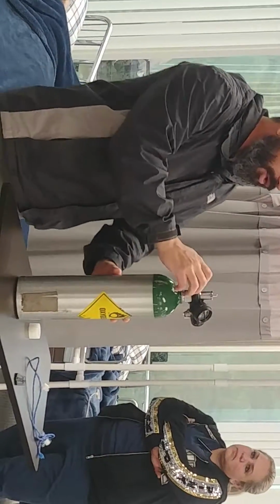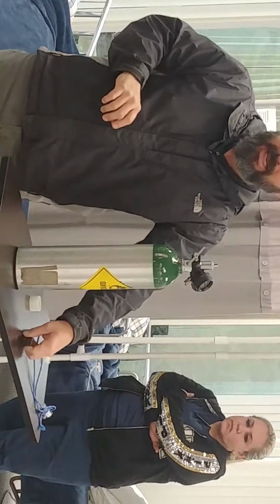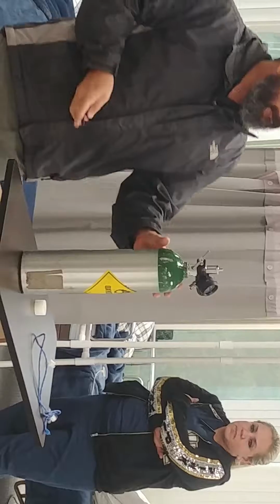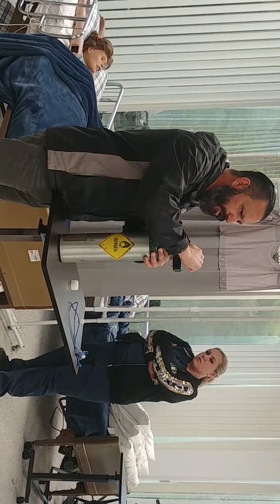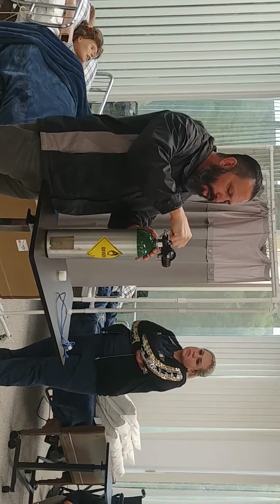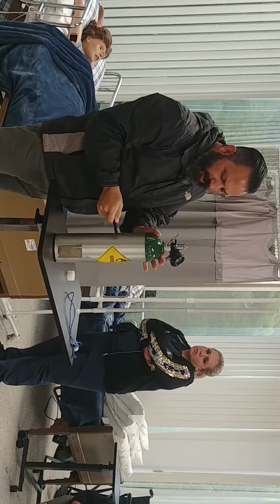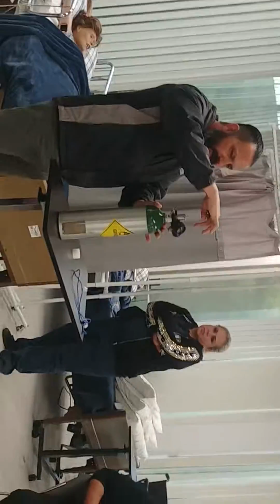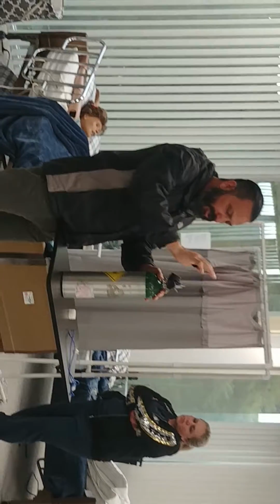Okay, so the first thing that we're going to do is take the regulator off. But how are we going to take this off of here and swap out? There are some steps that we need to do. When this bottle is open, just like anything else, it's left to loose, right to tight. So when we open the bottle, left to loose, we're getting the oxygen coming from the high pressurized tank. Now it's going to feed into the regulator. Now it's just sitting in the regulator, ready to be dispersed.